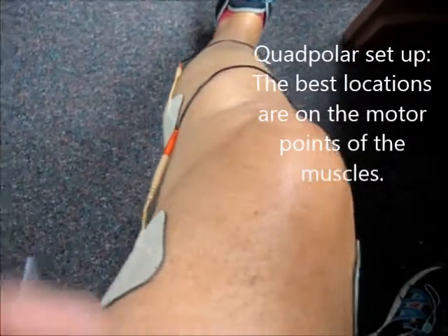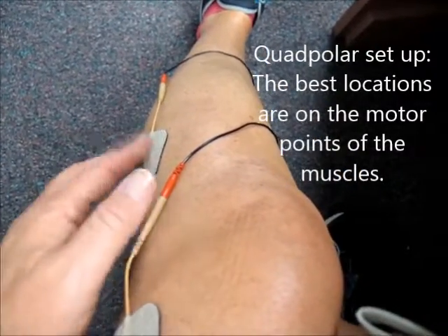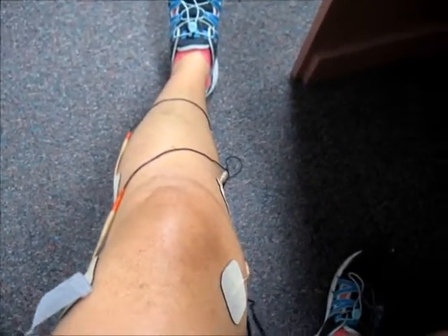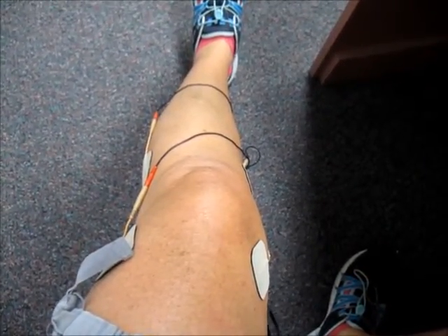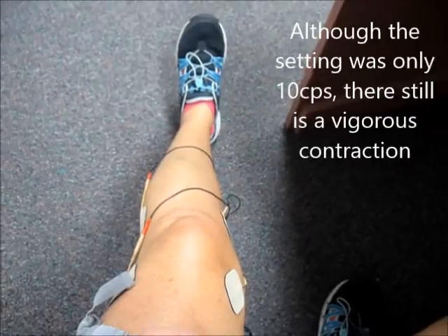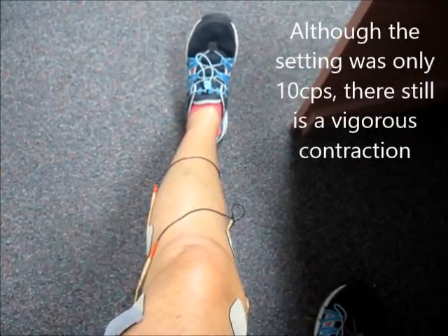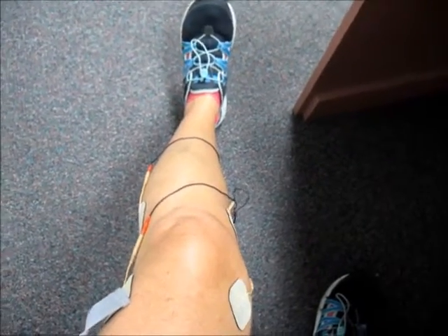The best of all these pads is actually this one right here because it will actually make the whole leg contract. See if you can see the whole leg contracting — I'm going to turn this on right here. See how the ankle moved and then let go. And the ankle moved and then let go. Let's do the whole foot so you can see this. I'm going to go on and then let go. So obviously it's been put on the fibularis over here.